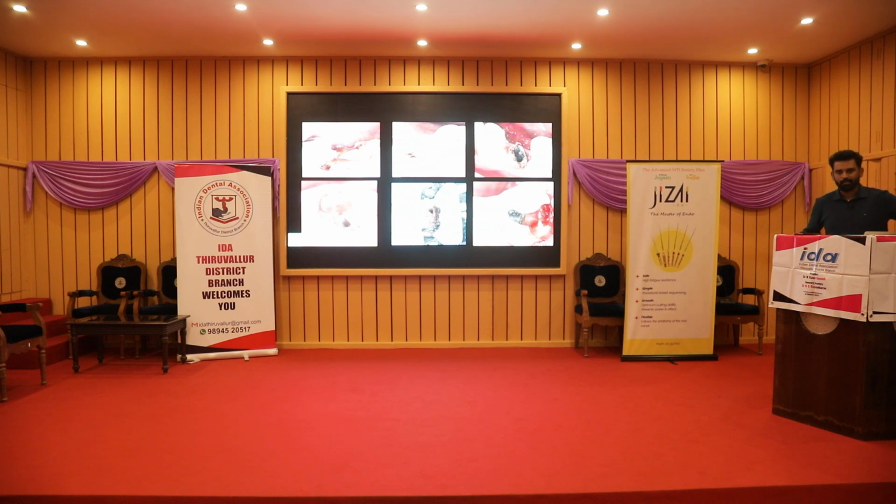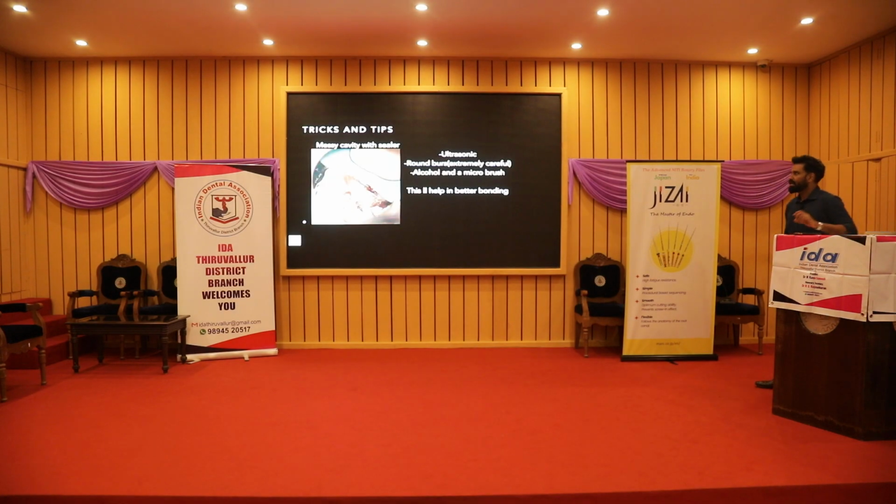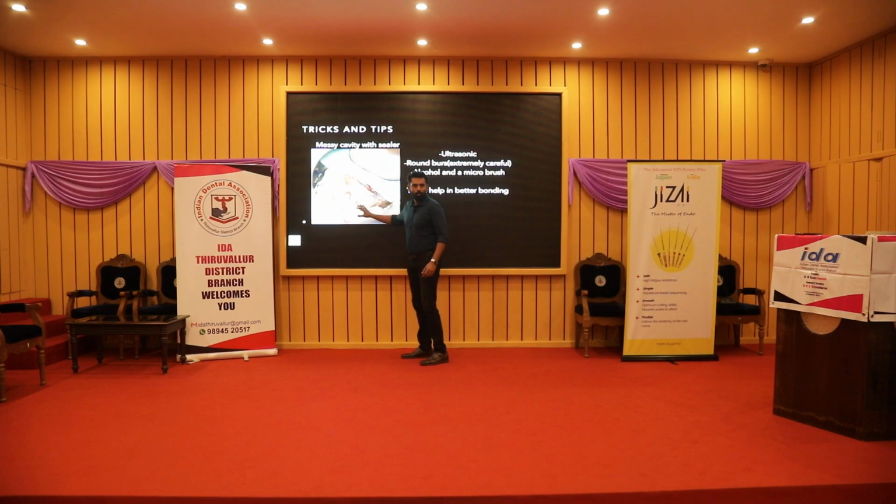Now the tooth is almost like this. I'll take another 10 minutes somehow. So right now the tooth is like this. After doing obturation, it will be like this, right? In many cases it will be like this. There will be a lot of sealer here on the floor.